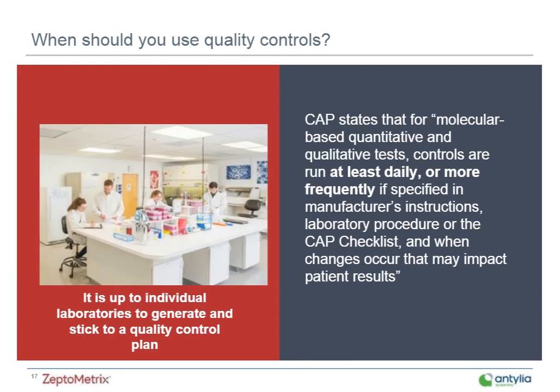If we look at what CAP says, they state that for molecular-based quantitative and qualitative tests, controls are run at least daily or more frequently if specified in manufacturer's instructions. So I think when to use quality controls depends really on how you're using them. Quality controls are versatile.